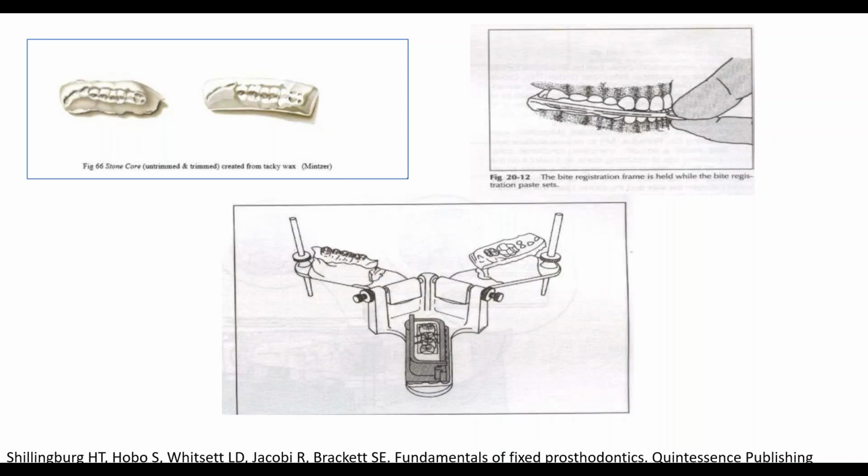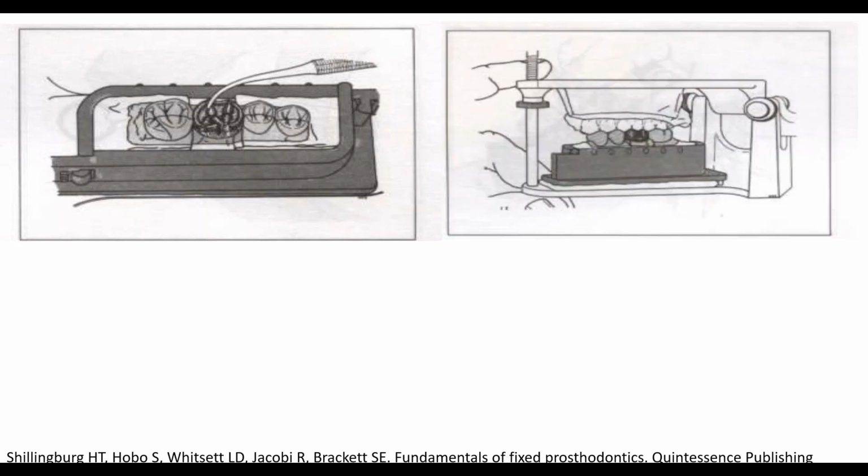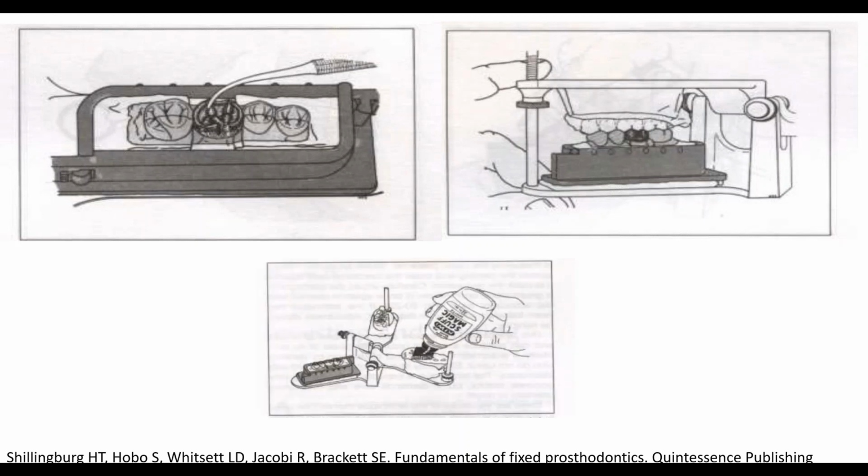With the help of the twin stage occluder, on one side the opposing teeth are attached, and on the other side the functional core is attached, along with the base member and the base. The upper occluding teeth are attached on the twin stage occluder. After the tooth preparation is done on the functional core, the proper wax pattern is prepared and occluded on the twin stage occluder, and the anatomy is checked. To check the high points, shoe polish liquid can be used. It is applied on the wax pattern and high points are checked.